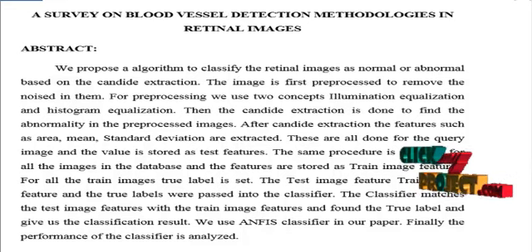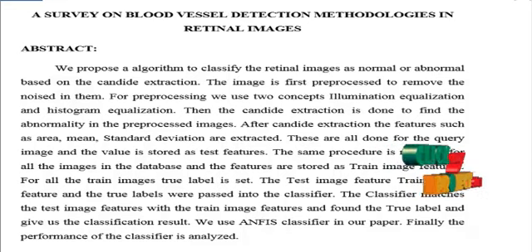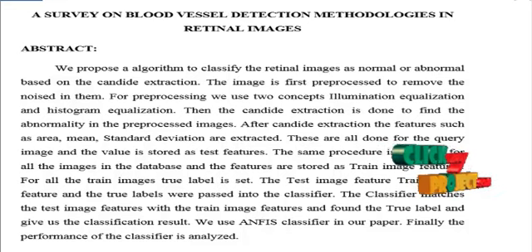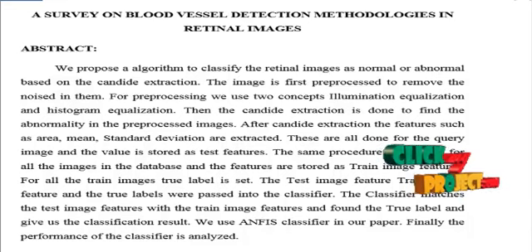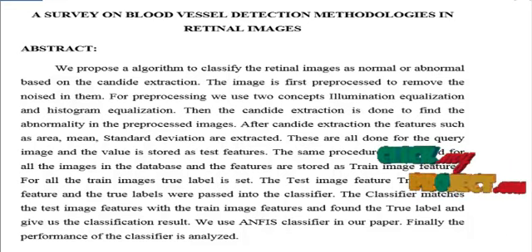These are all done for the query image and the values were saved as the test features. The same procedure is repeated for all the images in the database and the features were stored as the trained image features. For all the trained images, true labels were set.